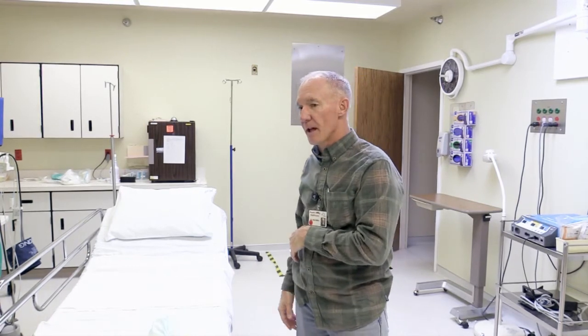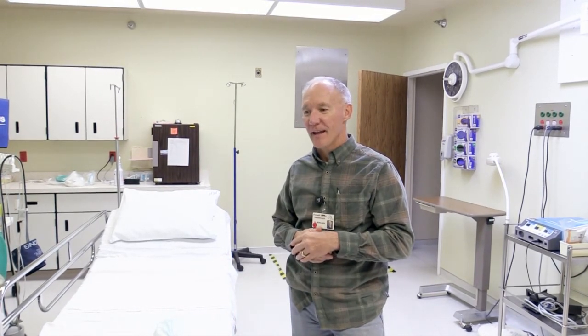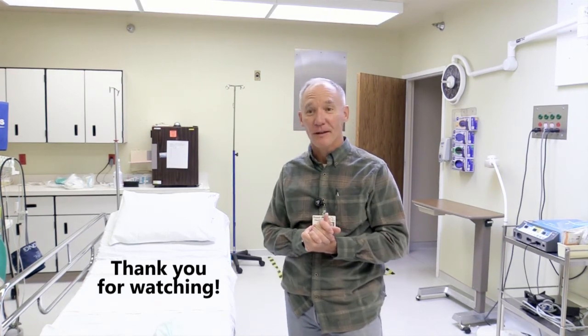After the colonoscopy's done, then we go back to those rooms where you had the pre-op, where they put the IV in, and then your family meets you in there, and then the doctor often comes in there and tells you what they saw or didn't see, because most of the time you don't remember while we're in here. And then, if they did a biopsy or something, then we send those to Billings to have the pathologist look at the biopsy or the polyp under the microscope, and then normally within a week we get you the results of that. So hopefully that makes you not as nervous about what a colonoscopy is all about.